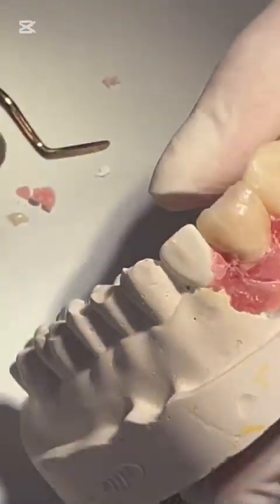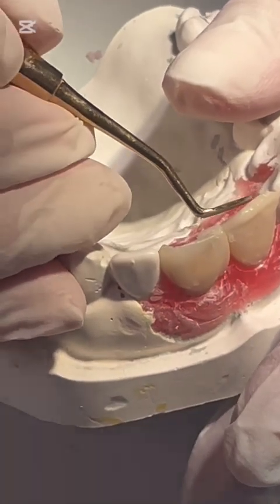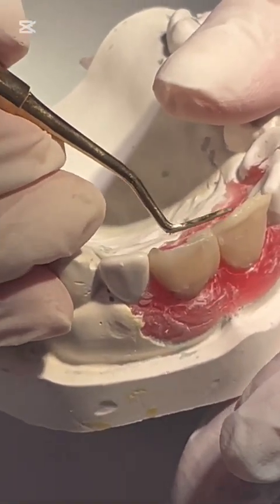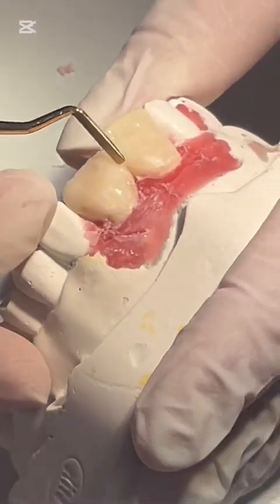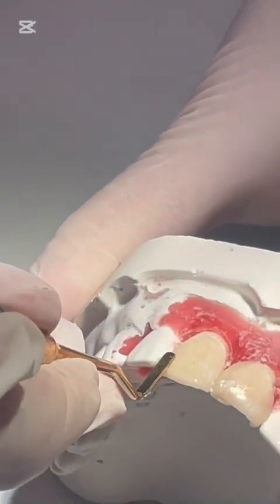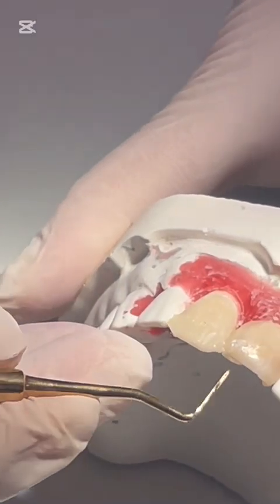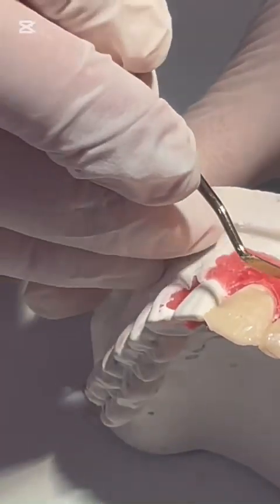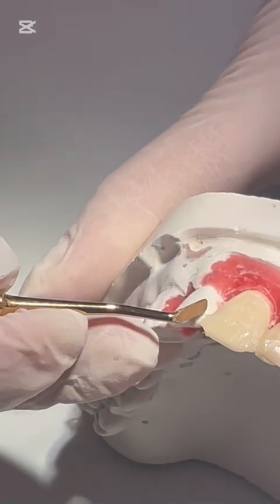Retention depends on the occlusion, on how much bevel you do, and the kind of adhesive you are using. But doctor, on the jaw you're working on, increasing the length will ruin the occlusion, right? That's why I said we have to increase the width, and check the bite before we take the decision. So if it is not allowing to increase the length, you should avoid it. You should go for apical reduction, which is crown lengthening or gingivectomy.